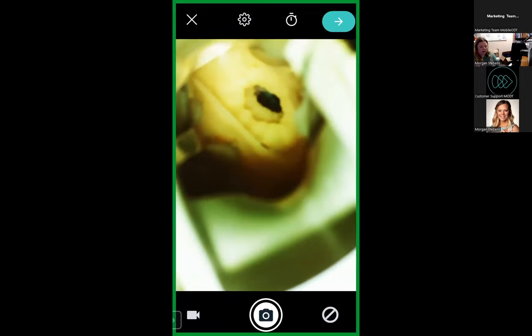You can turn your high contrast filter on here if you had bruising on the cervix. If you wanted to get a picture of an injury that's just a little bit different, that's what it looks like to use the system within the stand, the colposcope, and for full body photos.